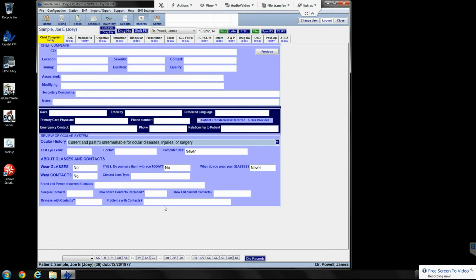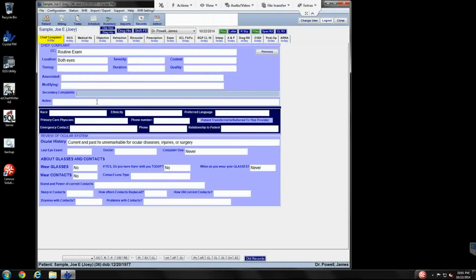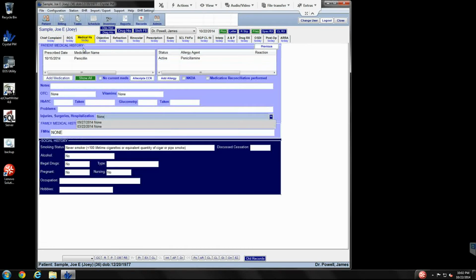Okay, for this video, we're going to do a brief run through of a glasses exam. First of all, most of the history should be filled out except for the chief complaint. Up here, whatever it may be, fill that in. Secondary complaint, HPIs down here towards the middle part here. And you can just review your histories, make sure everything is matching what's on the paperwork from what the technicians typed in.